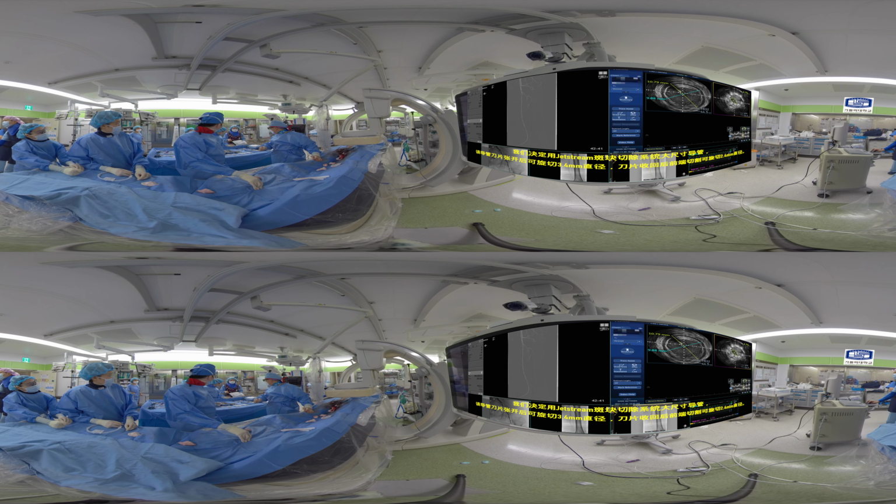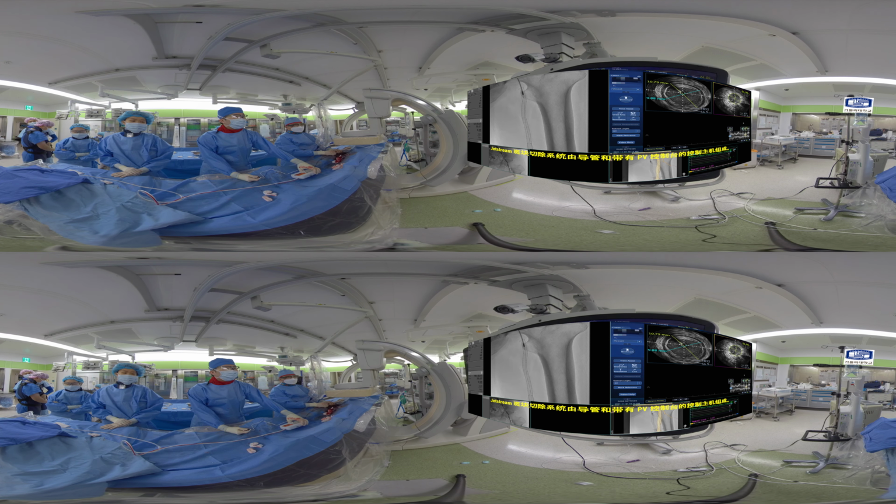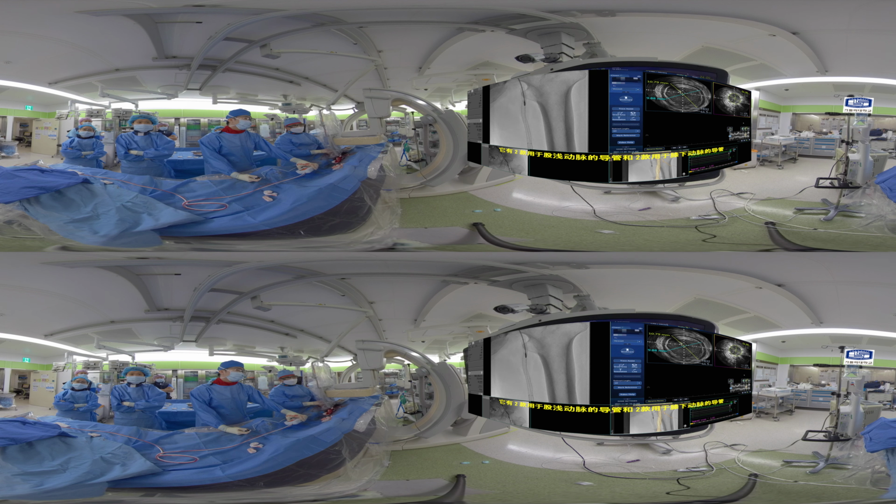We decided to use a large JETstream atherectomy catheter, which can cut 2.4 mm without blade up and 3.4 mm with blade up. The JETstream atherectomy system consists of a catheter and a control pod with a PV console. It has 2 catheters for SFA and 2 catheters for below-knee angioplasty.